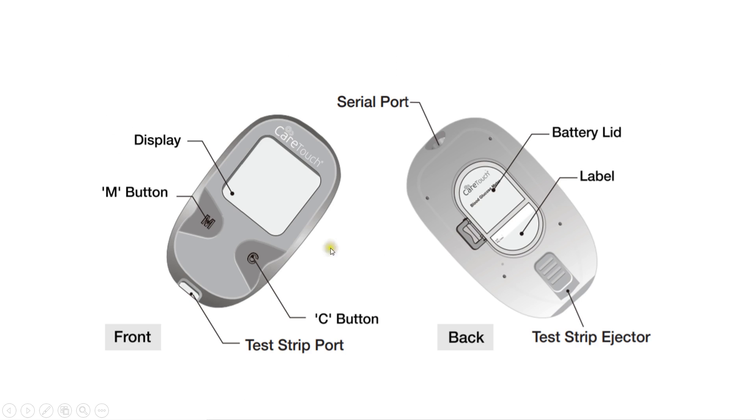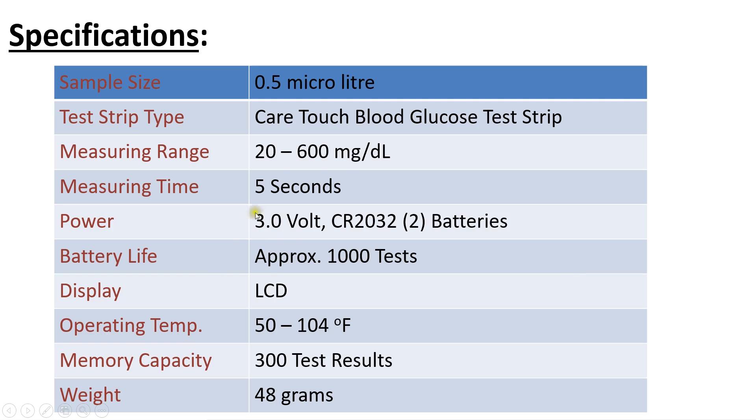These are the front and right side of the glucose meter. It has two buttons, the test strip port, a serial port for connecting to a computer or digital device, a battery compartment, and the test strip ejector button.